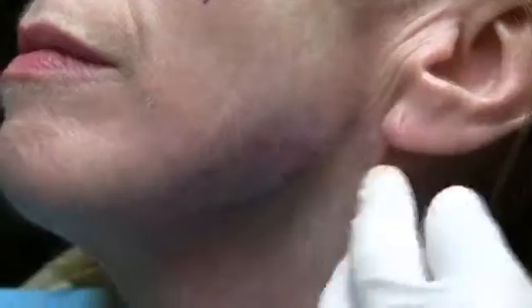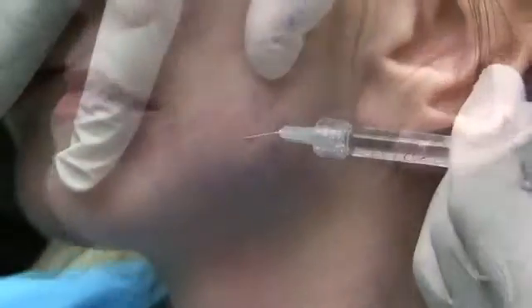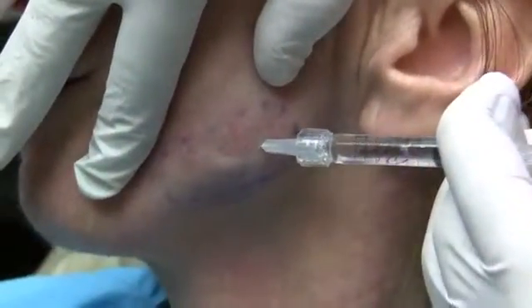But again, we are pretty much here intradermal and subcutaneous. The massage with filler is just as important as the filler. And that's an impressive correction with one syringe. A very impressive correction.